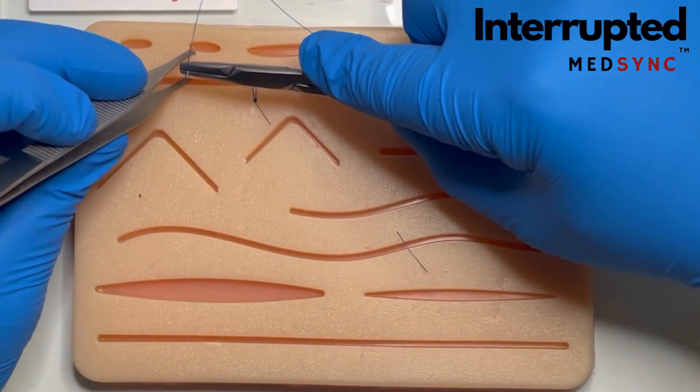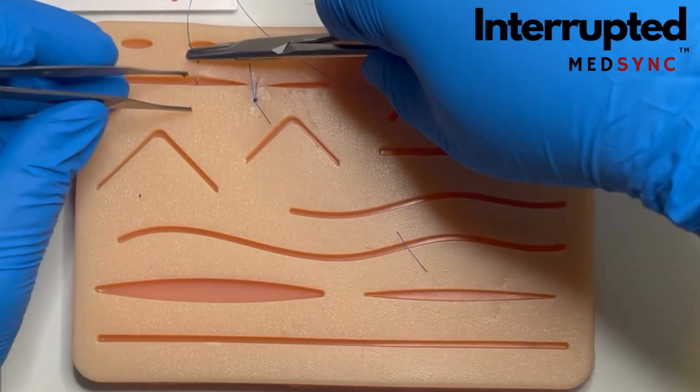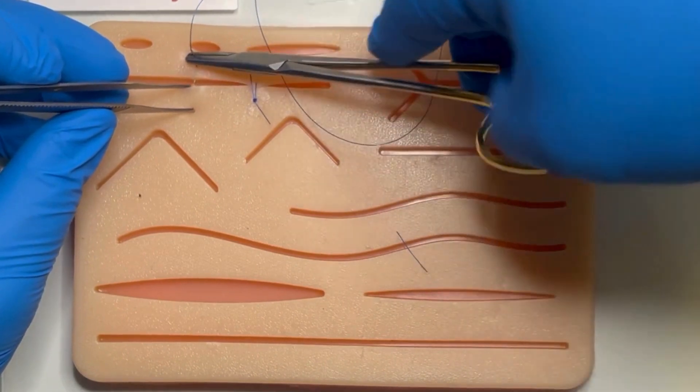Take equal bites across both sides. If there is a mismatch, take a deeper bite on the bevelled edge to lift it out.